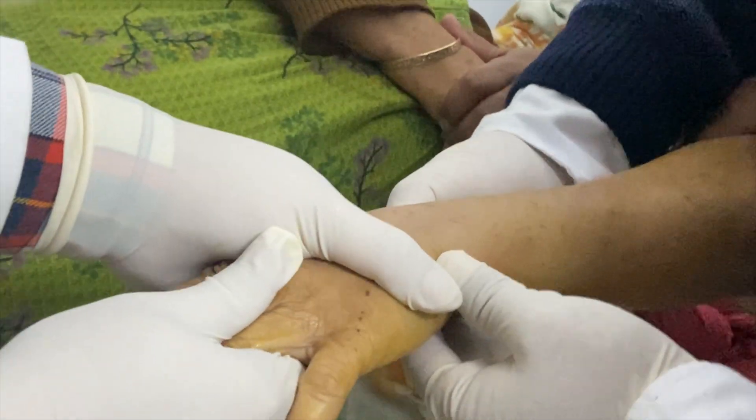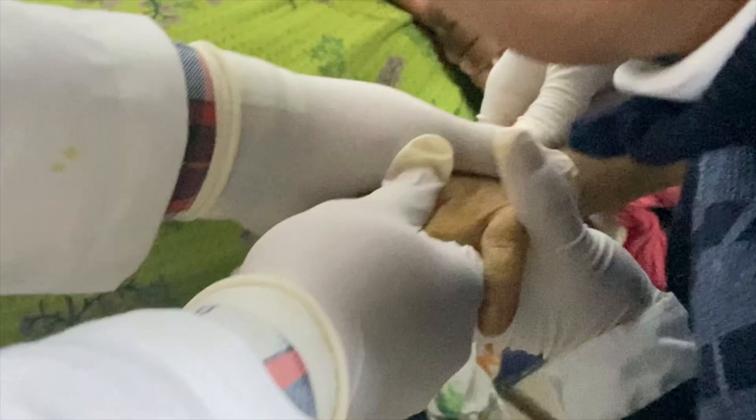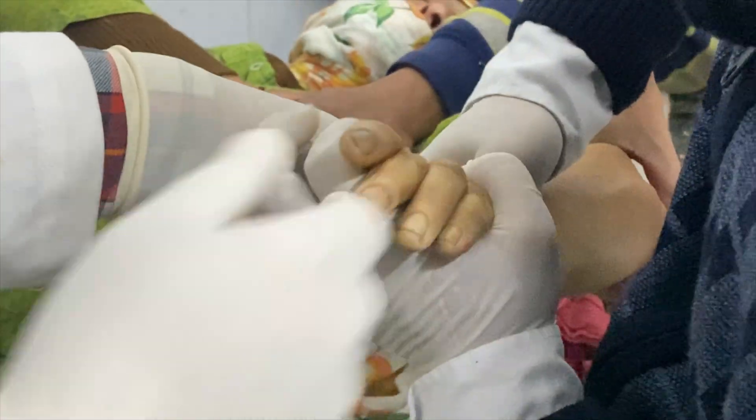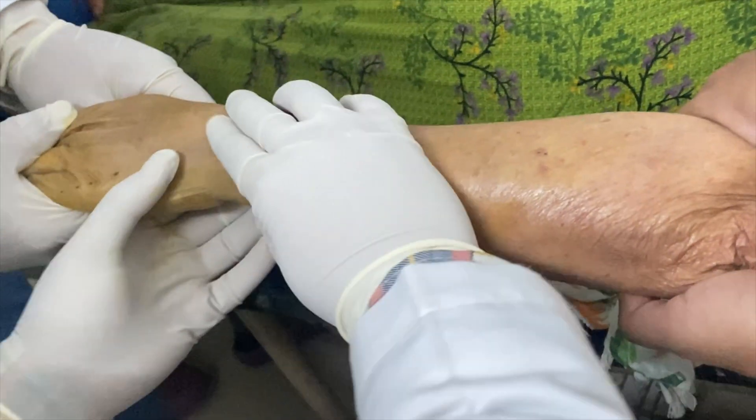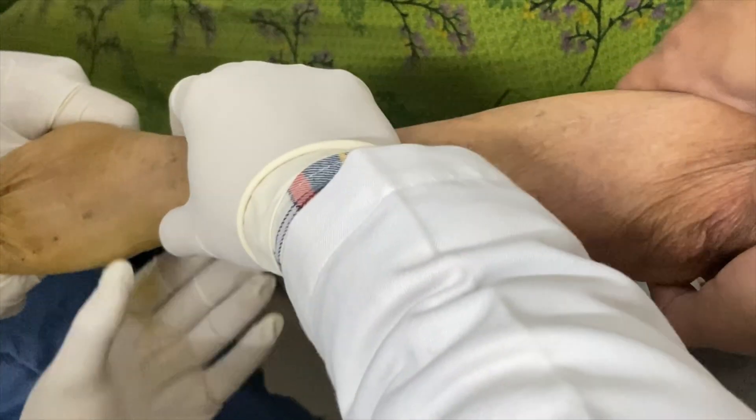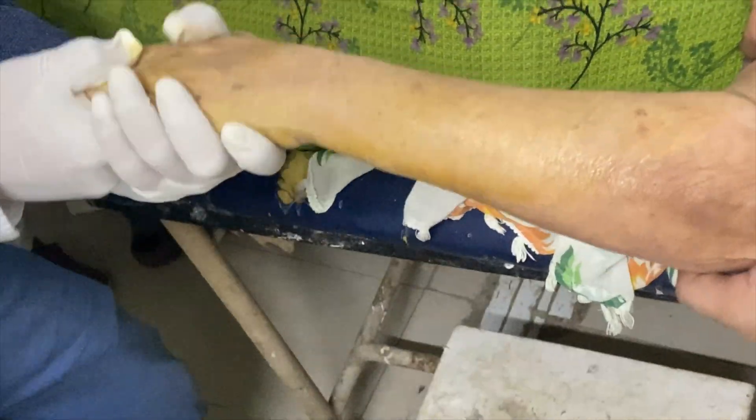The radial styloid is now at the correct level. The two common displacements here are dorsal and radial displacement, so I have to correct these deformities first. After manipulating, I am palpating all the bony prominences and seeing how much correction I have achieved.